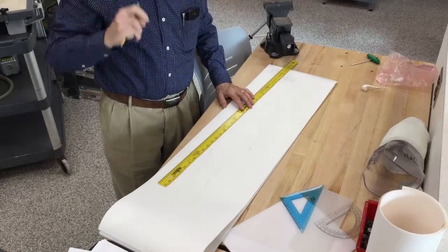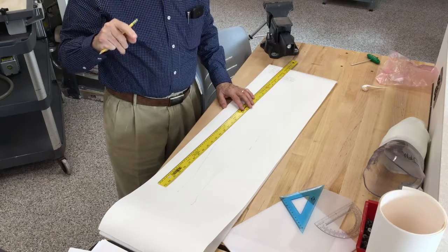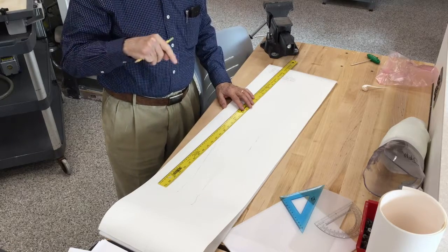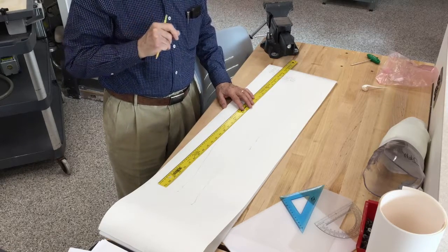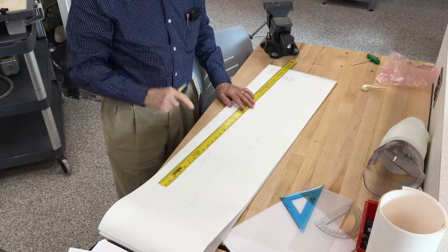There may be a question as to why we were getting an outline of the thigh and the perineum if we're only doing an AFO. The reason is that's what's used to establish the mid-sagittal line.